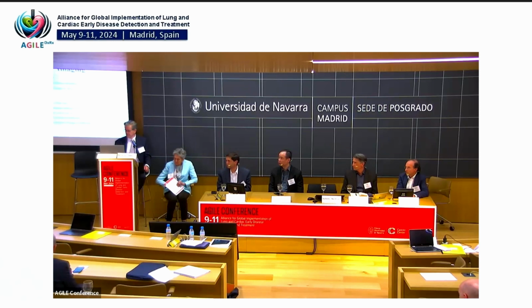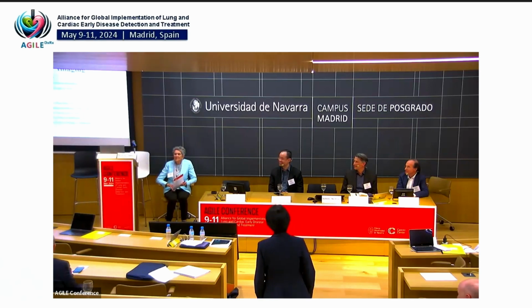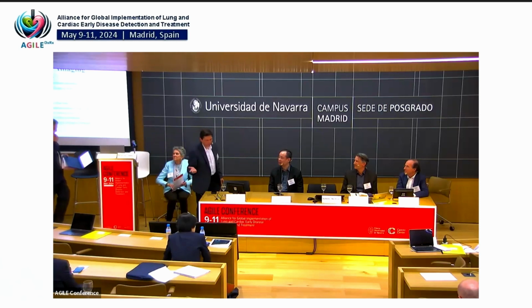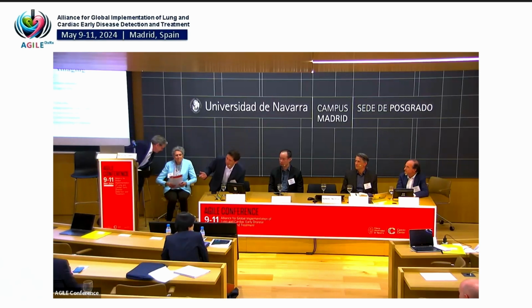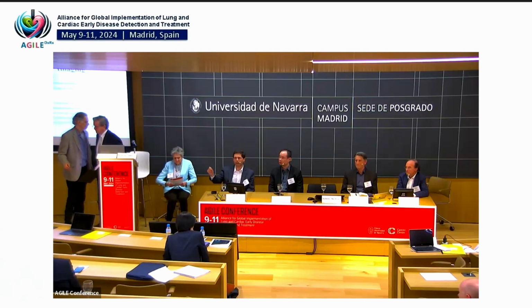How are you going to measure bias? You don't know what the true size is ever. So I'll pass around some 3D printed objects. Thank you, Claudia. I was hoping somebody would say that. So yes, real lung nodules we don't know the size of, but we can take a real scan and we can 3D print that object and send it around and put it inside of calibration phantoms all around the world. So I'm going to send you two objects. It's going to pass around.